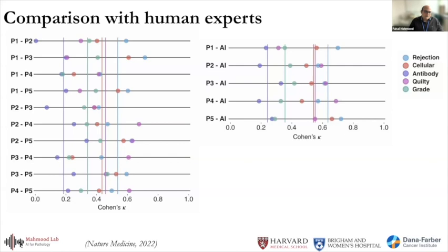In this case, one thing we found, and this is very similar to what other people have found in other studies, is that for this particular task, the cases where a consensus could clearly be developed were relatively very easy cases. So we took an alternative approach that has also been used in some other AI studies, where we compared the performance between 5 experts, and here's a plot of their performance based on Cohen's kappa, which also takes into account agreement by chance. Then we also compared their performance against an AI model, and we can see that there's some performance improvement here.